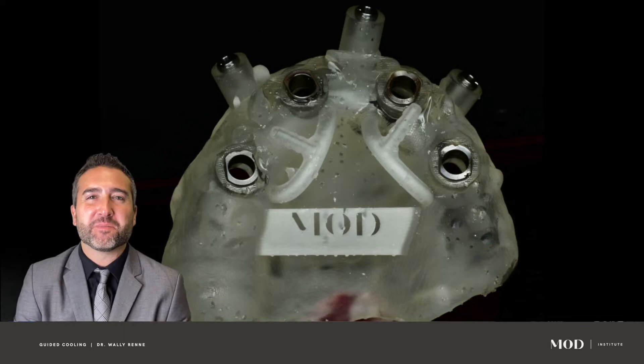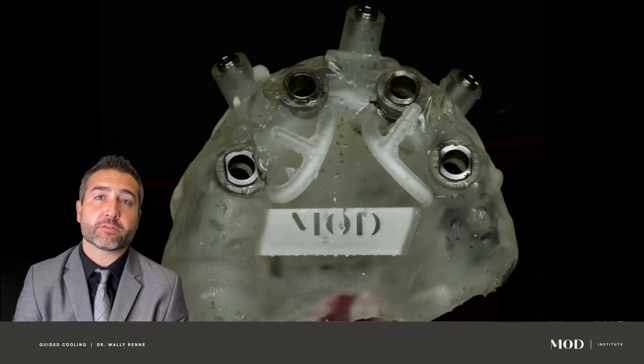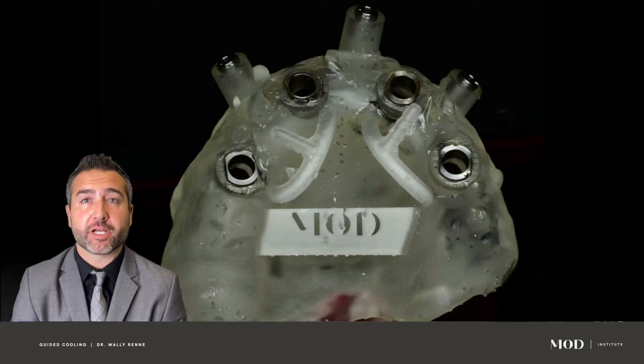Hey everybody, Wally Rene here from the Mod Institute. Welcome to this little clinical guide on how we can create internal irrigation into our surgical guides.